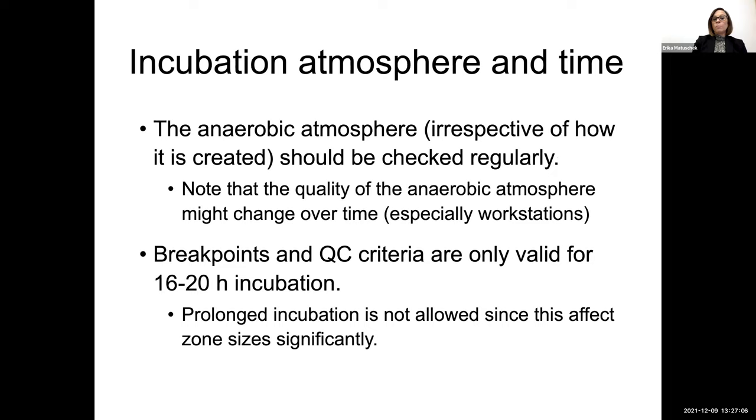I will just mention the anaerobic atmosphere, because Ulrik will talk more about that in a short while. But it's important to know that the anaerobic atmosphere has to be checked regularly. And it's also important to know that if you use a workstation and use it a lot during the day, adding and removing plates, that will affect the anaerobic atmosphere. It will then change over time and not be stable.